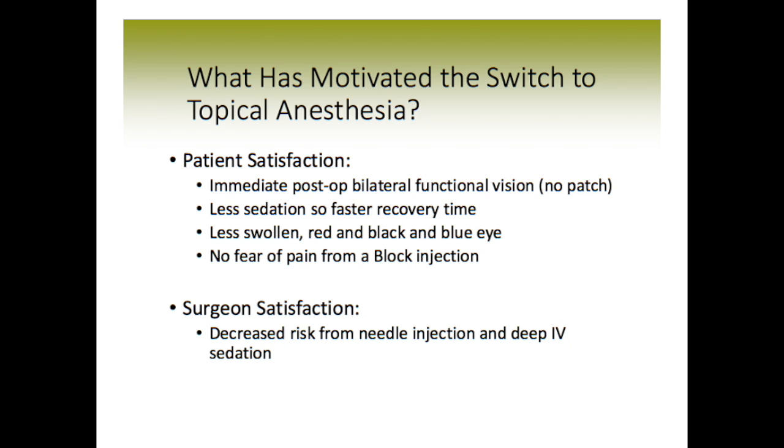No surgery's been done yet, but you're all nice and numbed up. The lids don't blink, the eye doesn't move, and the eye's all numb. With the topical anesthesia, the eye drops don't hurt, and so you certainly don't need deep IV sedation for that. But some patients commonly like a little bit of sedation through the IV for the topical surgery just to take the edge off of things, but it's mild.